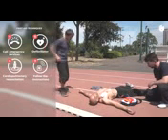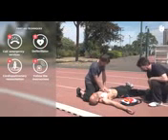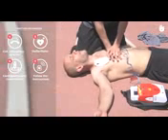Continue in this way until the emergency services can take over, or until the casualty begins breathing normally again.